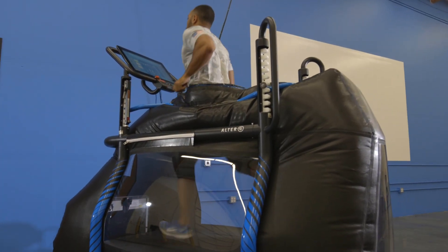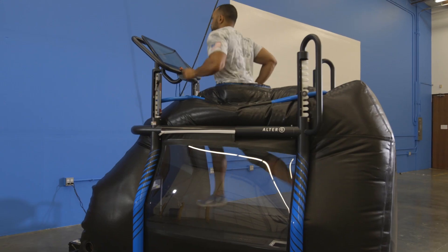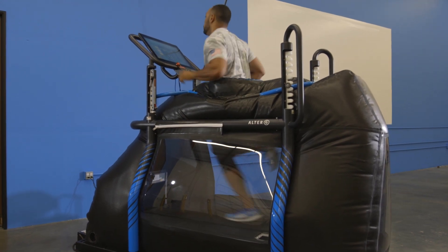The AlterG Assistant helps you maximize your time and productivity by allowing you to choose from a variety of pre-programmed workouts or customize your own based on each athlete's unique needs.